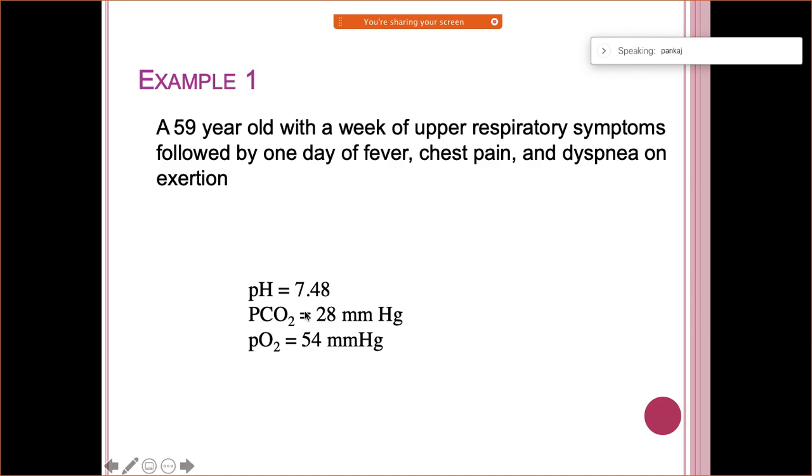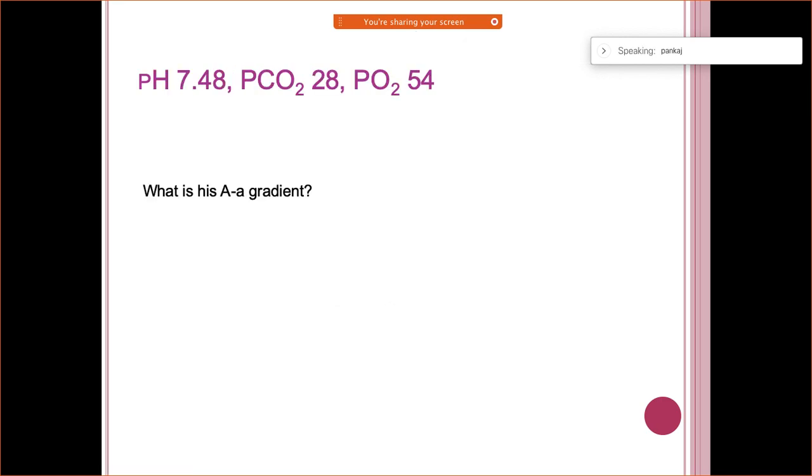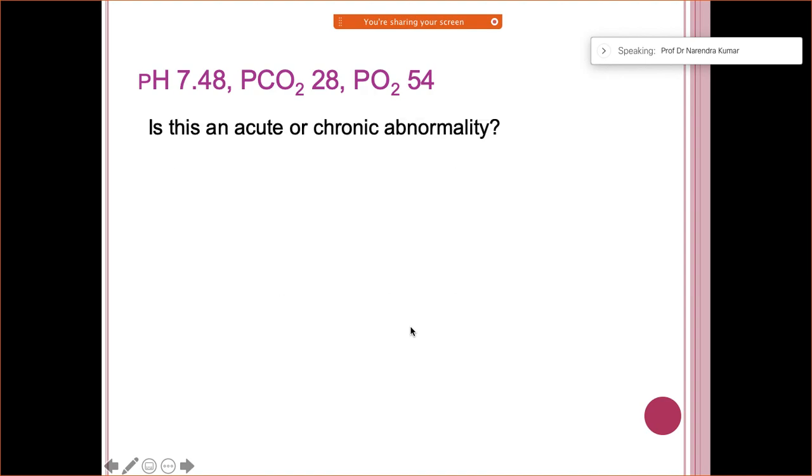Right. So, what do you think so far? This is alkalosis for sure, by looking at the pH. And by looking at the PCO2? Wonderful. You are all so smart. Okay, now the next level of question. You have all these values, so you already know the answer for this. Now, the next question I'm going to put is whether it is acute or chronic. How are you going to calculate? So, this is the formula, if you want to use it.